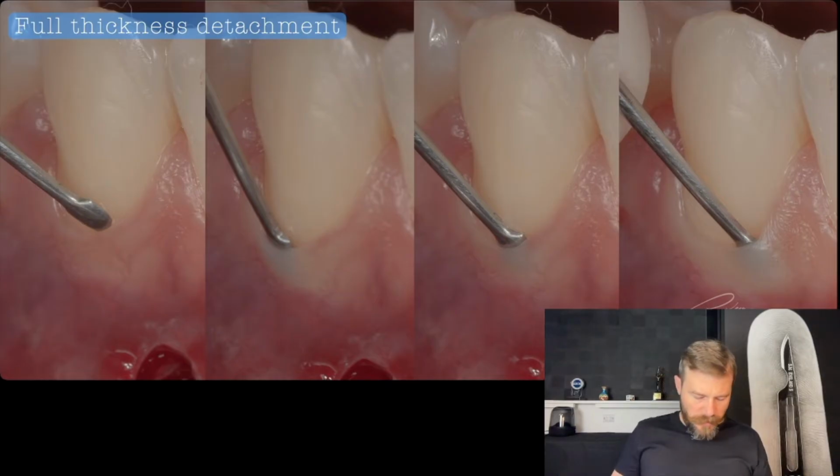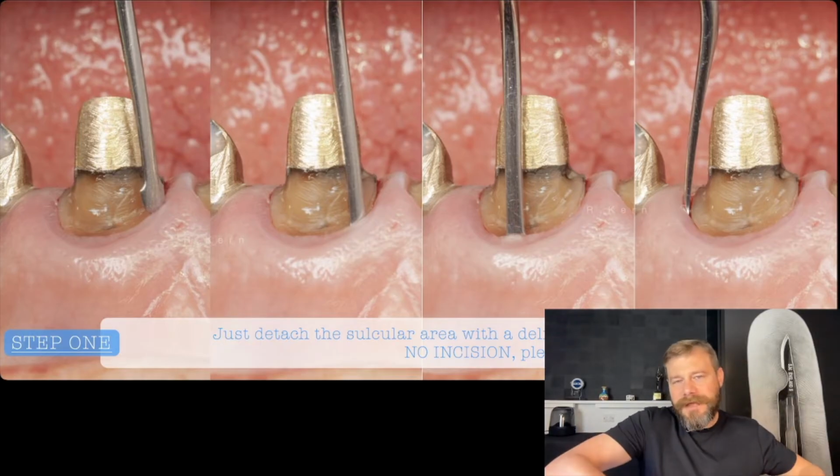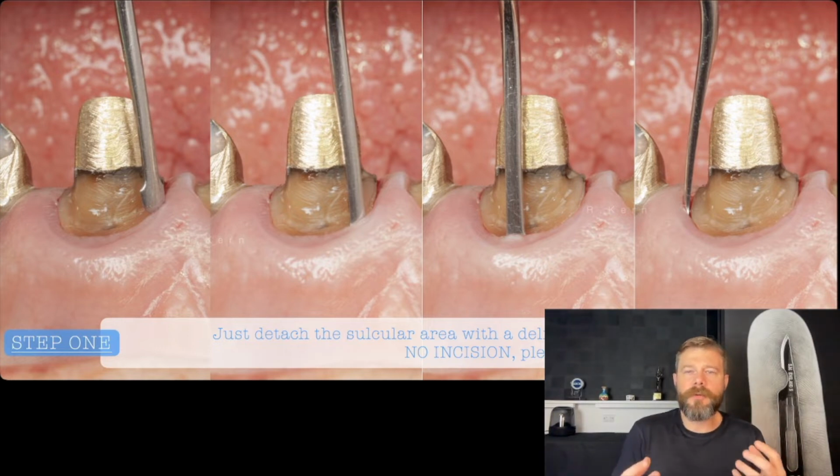So what we do, we avoid that. We try to detach the whole flap from the border, preserving the whole structure. So we do not make an incision inside this area anymore. We promote a detachment with a tunneling instrument. That's why this tunneling instrument is super delicate.